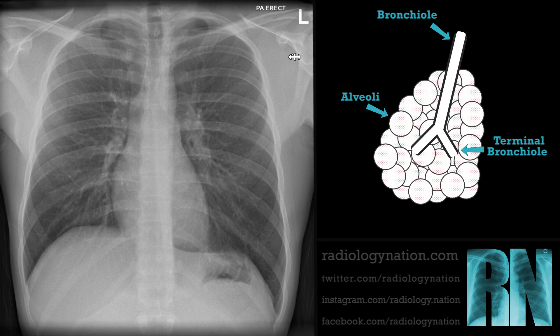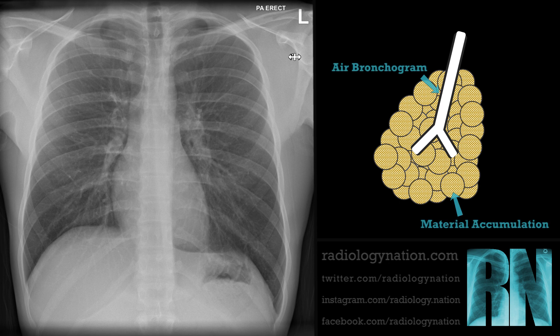However, it is often incorrectly interpreted as a synonym for pneumonia. Consolidation is confirmed by the presence of air bronchograms. An air bronchogram is an aerated bronchus or bronchiole that becomes visible as it is surrounded by opacified alveoli. On this image, dense consolidation has outlined a significant proportion of the branching bronchial tree.